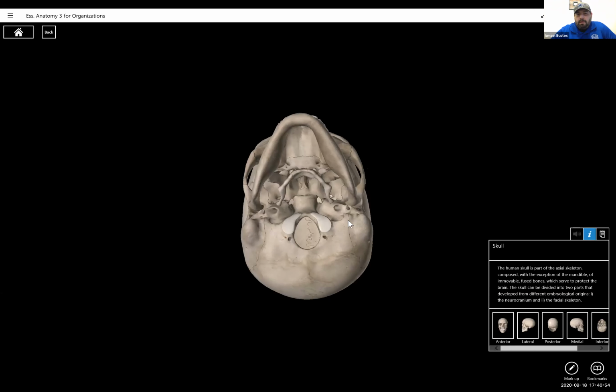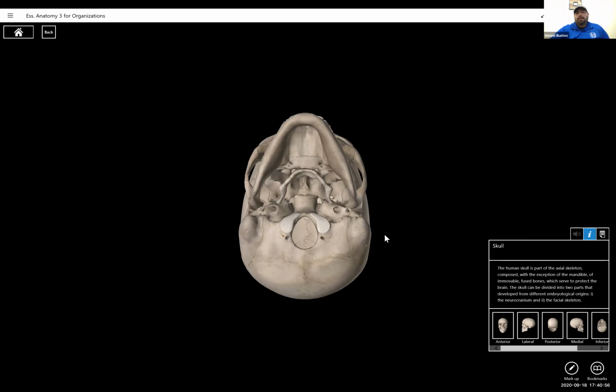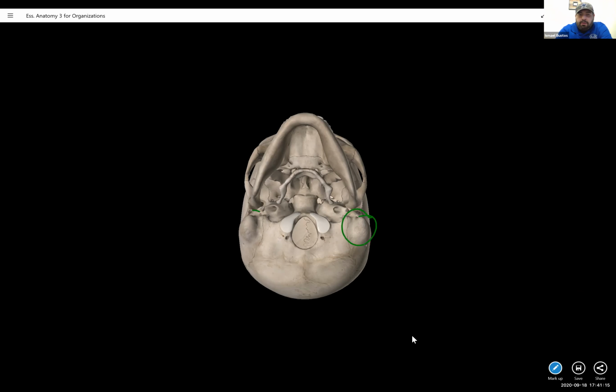All right. Other thing I wanted to show you. How can we tell if we have the correct SMV projection? Well, you want to make sure that the mandibular rami are not superimposed into the mastoid area. So the mastoid area is here, and here are the mandibular rami. We want to make sure that the mandibular condyles are not superimposed over that area.